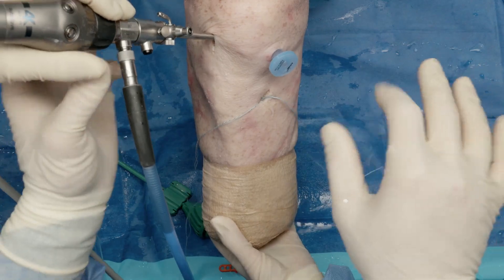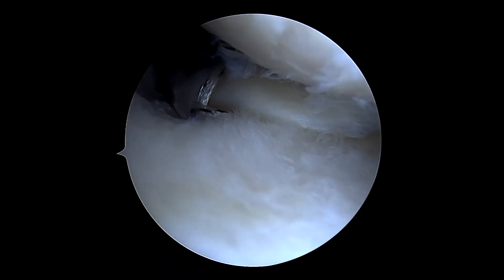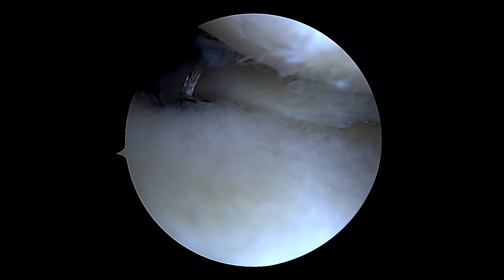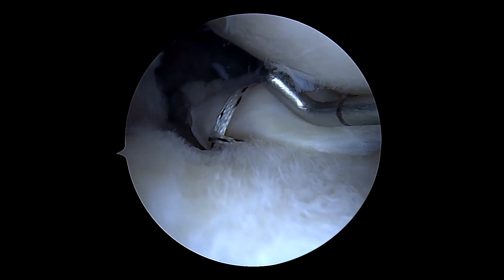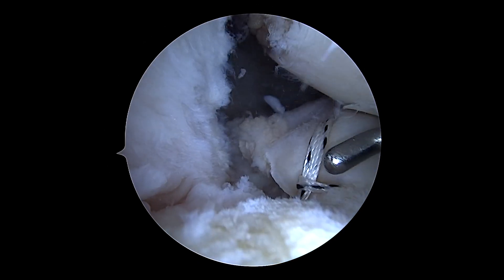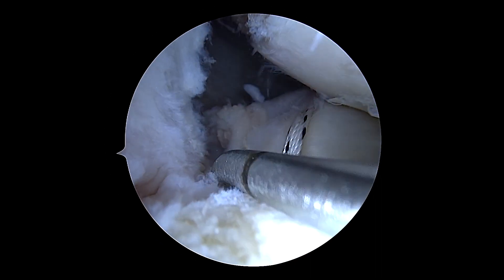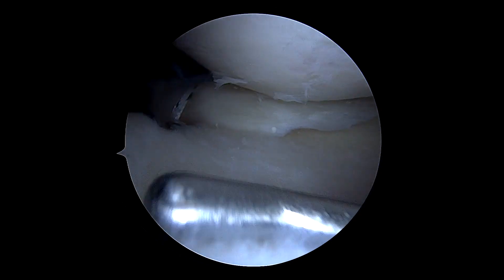When we go back into the joint we make sure we really have a nice reduction. If we're doing a concomitant procedure such as an ACL, we typically fix the root last once the ligament reconstruction is complete. Here you can see a really nice anatomic repair — our transtibial guide point-to-point hit our spot with really nice fixation for this medial meniscus root tear.